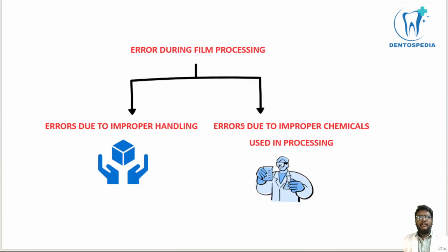And coming to the errors occurring during film processing, there are mainly two types here: errors occurring due to improper handling and errors occurring due to improper chemicals used in the processing. In the film processing, we might have learned about the developer and fixer, and if there is any deviation in the composition, we will get certain kinds of errors, and we will learn these in the further slides.